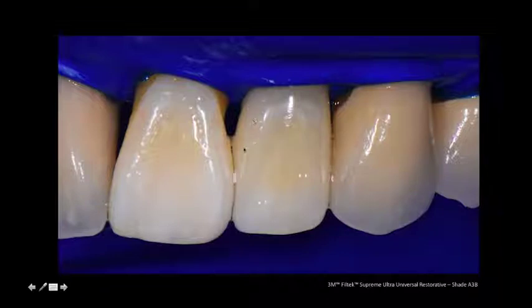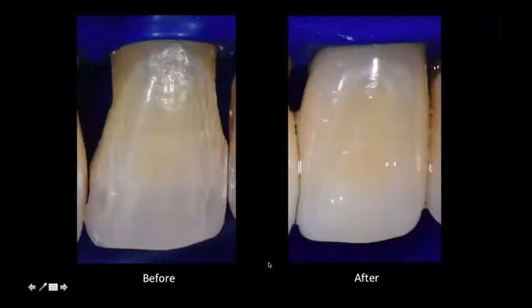But you can see in these interproximal areas where I'm trying to block out the black background in those open gingival embrasures, we got some nice color blockage. But by thinning out the composite on the facial, we got some nice coloration to show through. And so you can see there the before and the after. Basically we did some color correction because all the craze lines have been masked, but still the middle body coloration is allowed to come through, and then just a little hint of the incisal translucency.